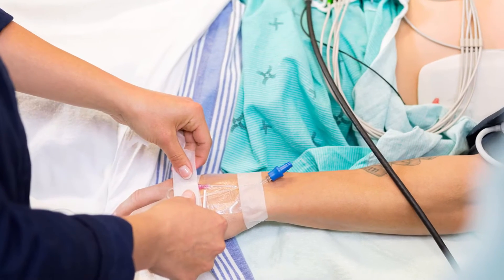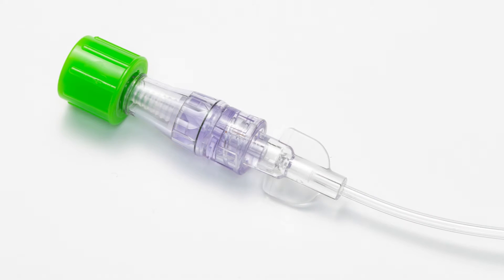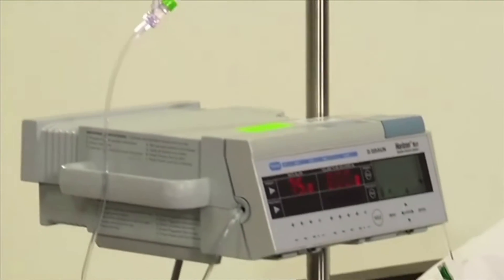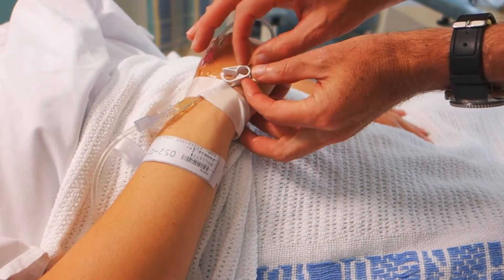For IV maintenance, Curos devices have continually advanced the application of passive disinfection — from needleless connectors to male luer connectors to Tego hemodialysis valves — all designed to disinfect and protect access points. Nearly all hospitalized patients receive an IV access device of some kind, any one of which may become a source for bloodstream infection.